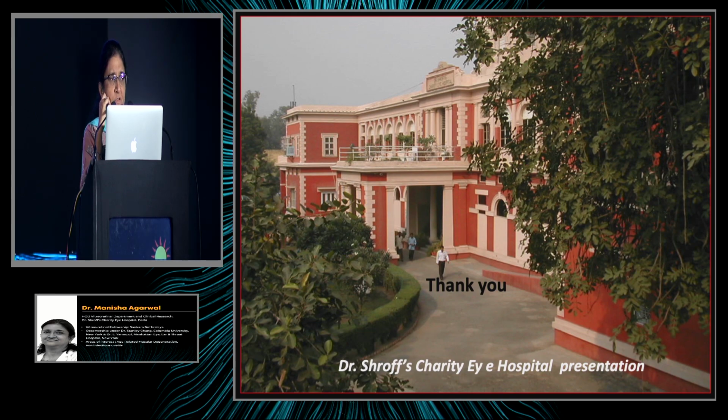I think very often we get to see these cases where we would be getting a cystoid macular edema. There will be no evidence of any active vasculitis on a conventional imaging. And we would keep wondering, because we would assume that the disease has totally died out with the treatment, but when you do an ultra-wide field, you would find a very active vasculitis lying in the periphery. And probably that would be the reason why the patient has a CME or a decreased vision.